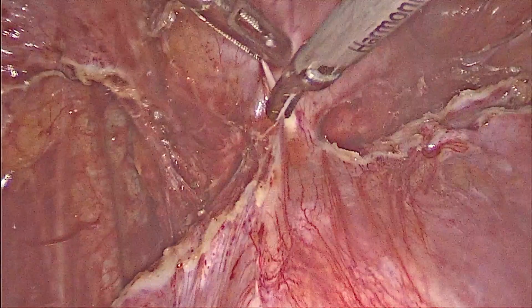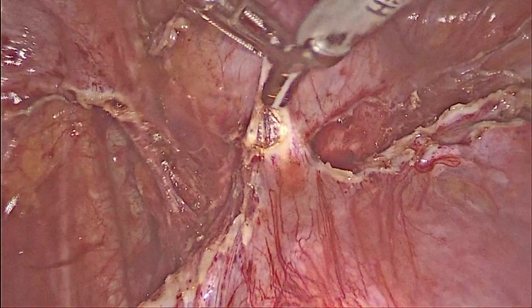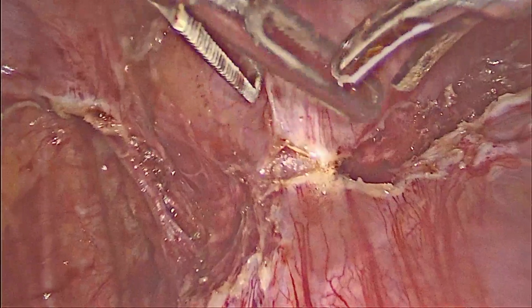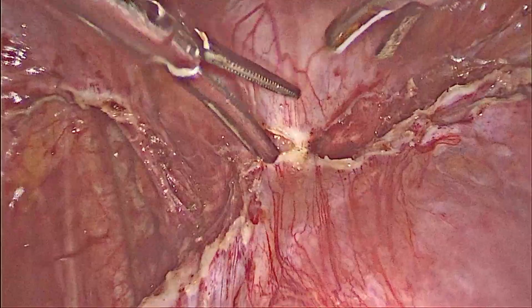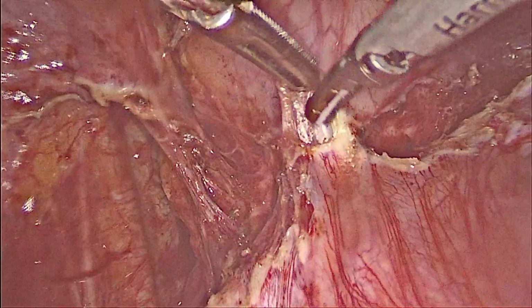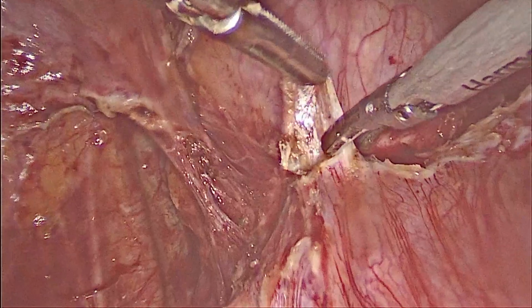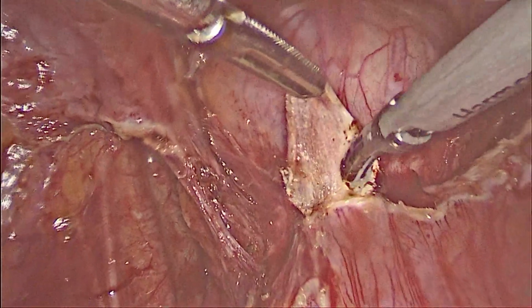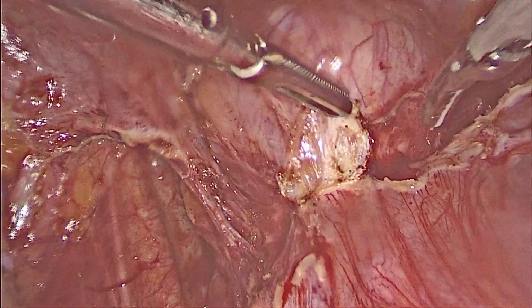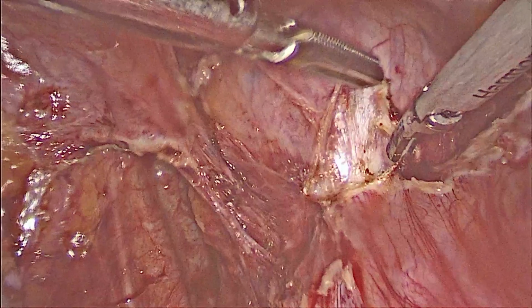So in this case, we are going for the anterior dissection, where the lateral dissection plane was not available. We tried to identify the lateral dissection of the bladder, but in this case the plane was not available. So we thought we'll go for an anterior dissection, where we are getting a better plane of dissection. This is dense fibrous tissue which needs to be divided, and then we can get exposure to the loose cellular tissue present between the bladder and the cervix. Then we can separate it well away from our surgical field.